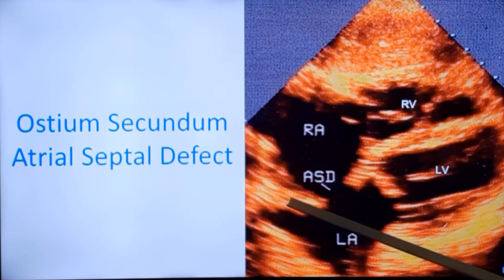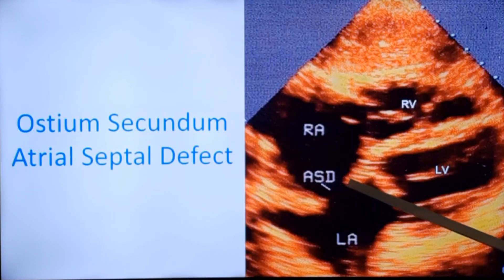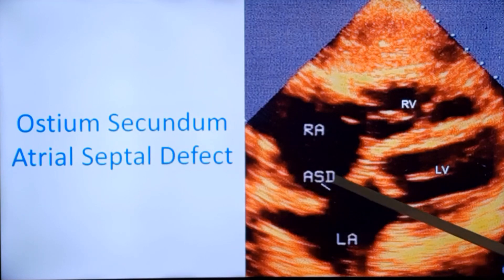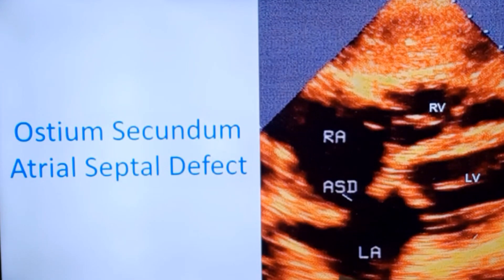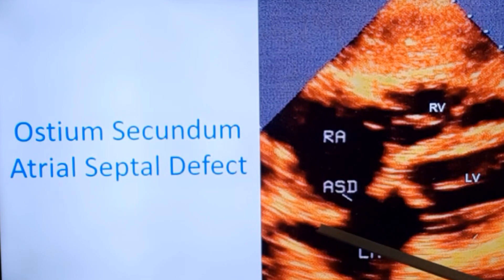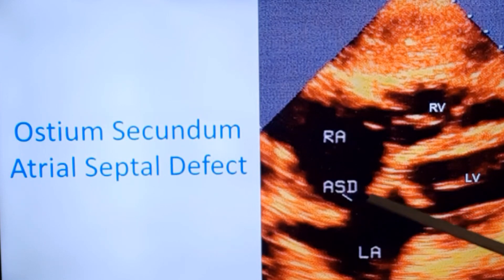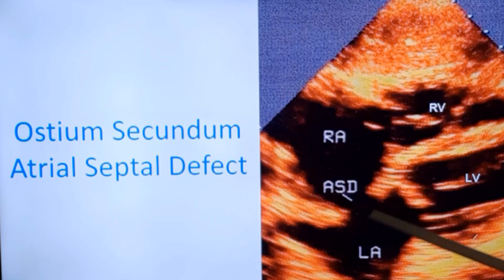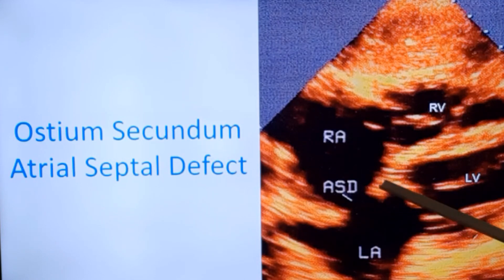There is a good rim above and a good rim below, so it will be suitable for device closure of the atrial septal defect. The device has two flanges, one on the right atrial side and one on the left atrial side. A good rim on all margins is useful to retain the device in situ after deployment; otherwise it can break loose and get embolized into the circulation.